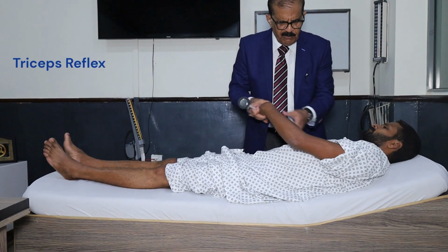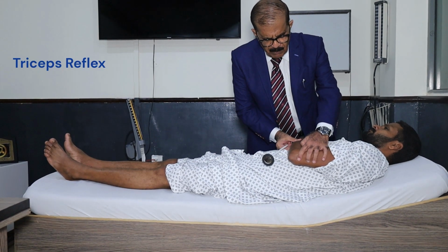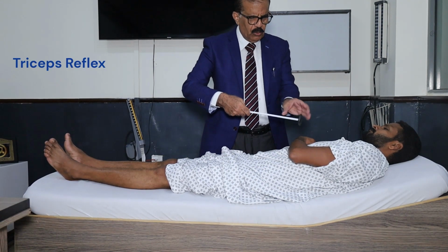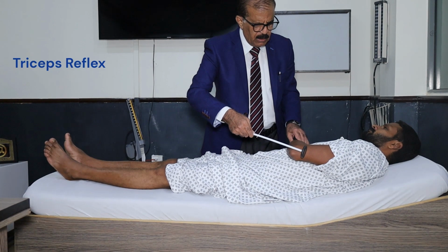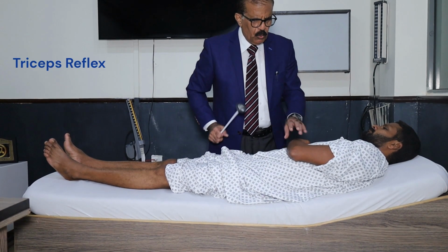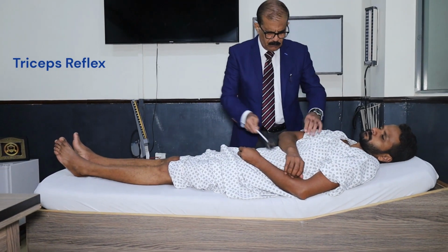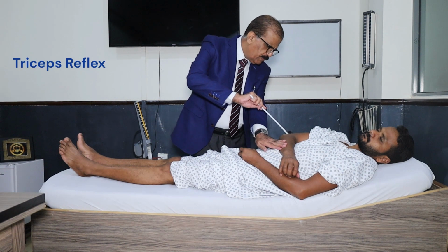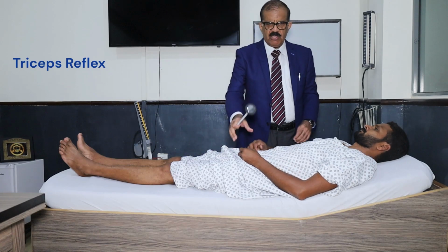Okay, this was the brachioradialis reflex. Now we do the triceps. Very convenient. We can just flex the arm like this, and this is the part where I'm going to strike. First I'll put it here. I think it is best to hold the handle from here so that you get maximum flexion. This is the movement you are expecting. So this is normal. Then I do it on the other side. I'm going to see this movement and also the muscle contraction. So like this. This was the triceps.